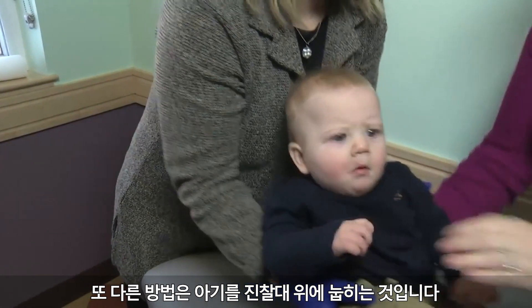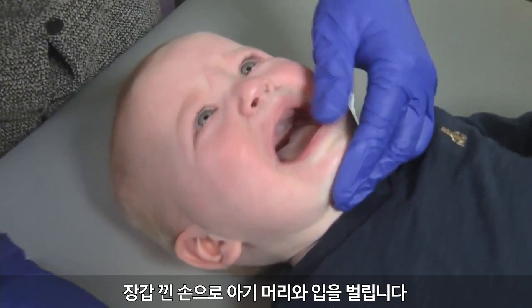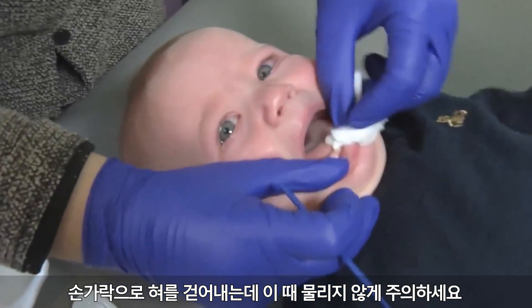Another option is to place the child on the examining table. The parent can help by holding the child's hands. Use one of your gloved hands to hold the child's head and mouth open. Hold the tongue out of the way with your fingers, but be careful to avoid being bit.